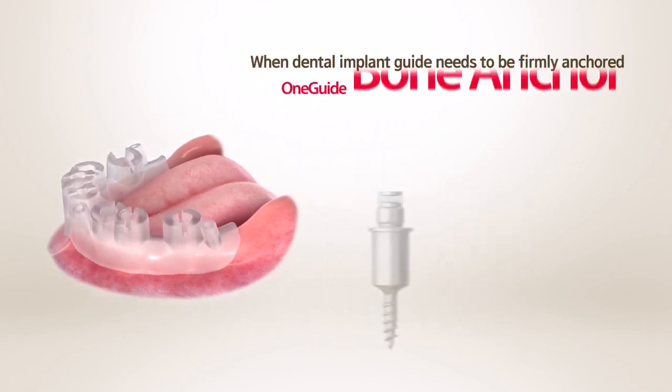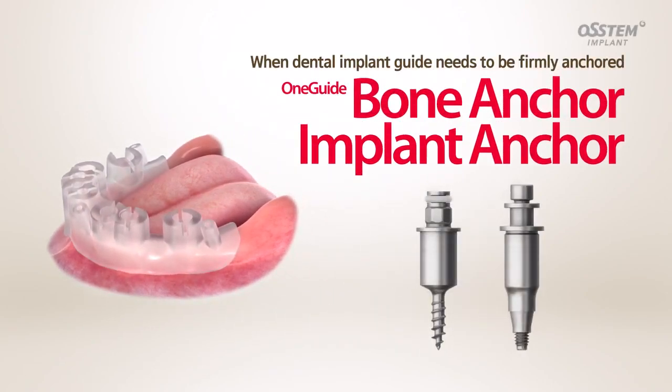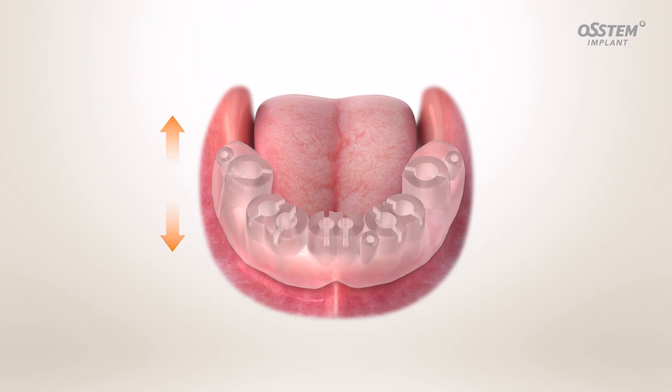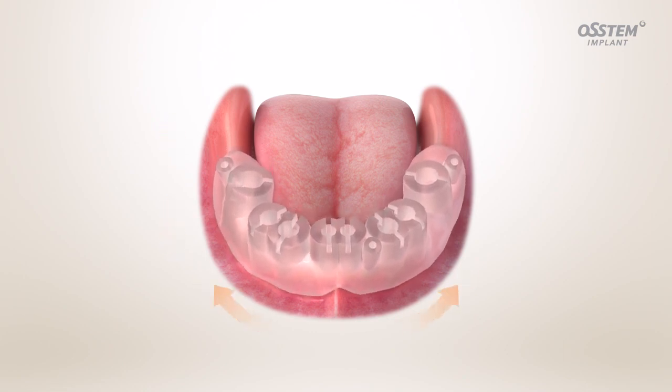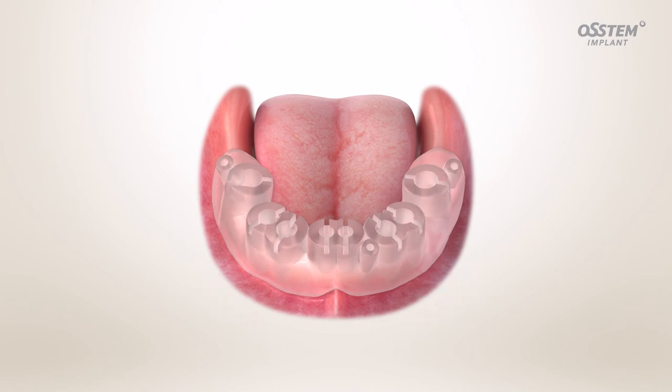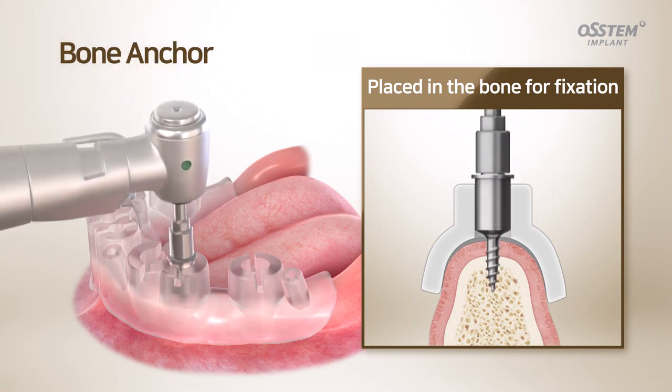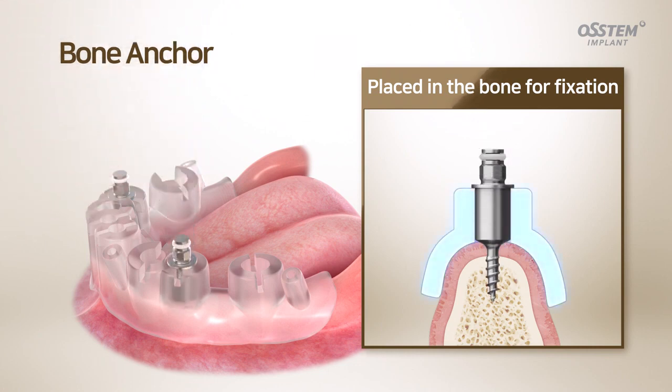Introducing the OneGuide Bone Anchor and Implant Anchor, which are used to fix an implant guide. The OneGuide Bone Anchor can be used in cases where it is difficult to anchor a template, such as completely edentulous cases or for patients with insufficient remaining teeth. You can place it vertically in the bone and anchor the template at the position you have planned.